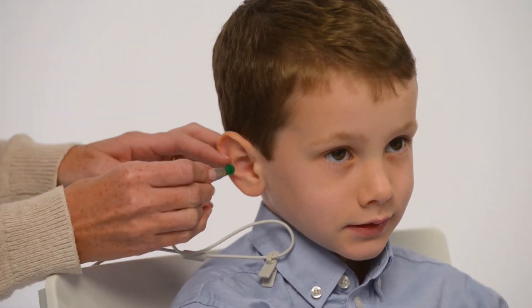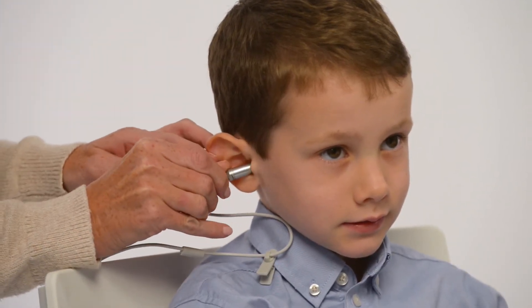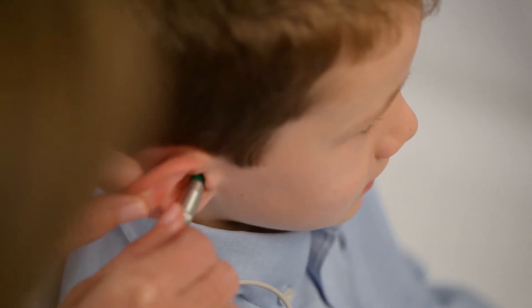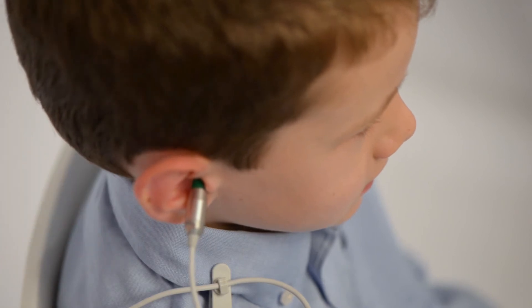To begin testing, clip the probe to the shirt to keep it out of the way. Power on the device by pressing the down arrow and insert the probe into the ear canal by first pulling up and back on the ear.